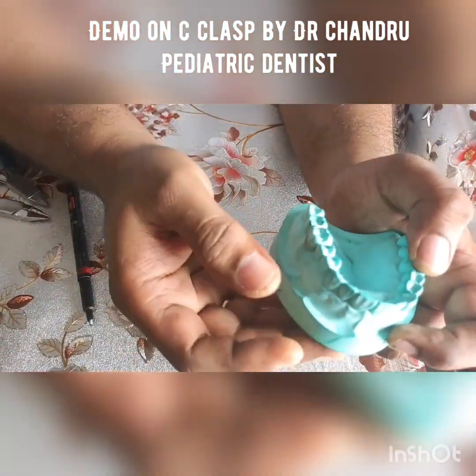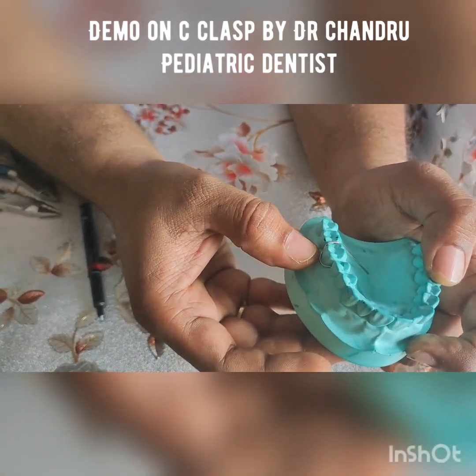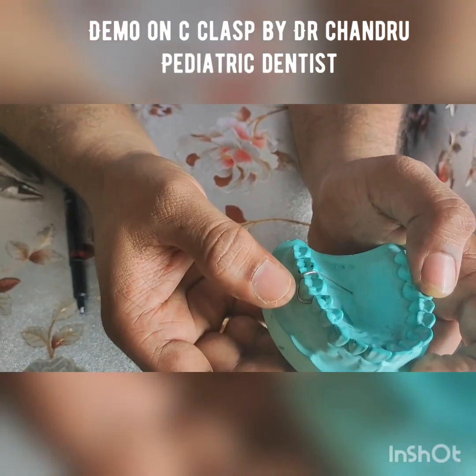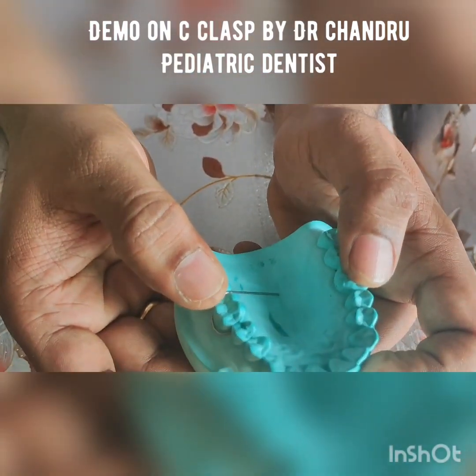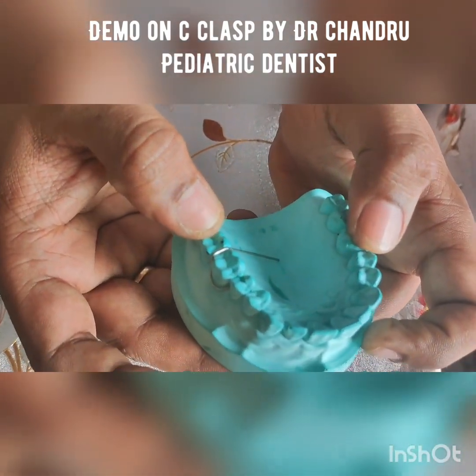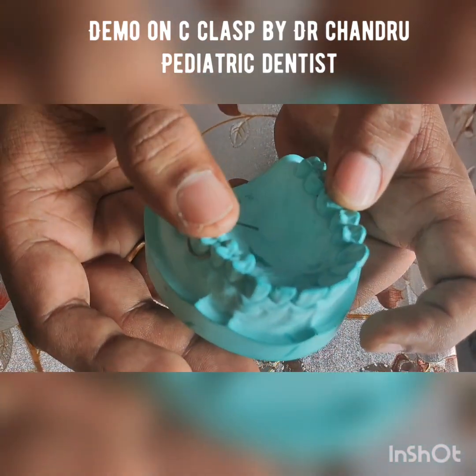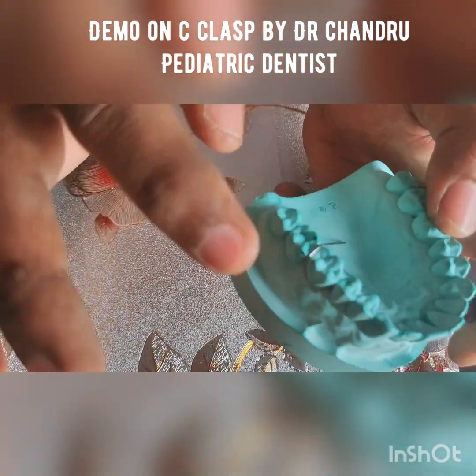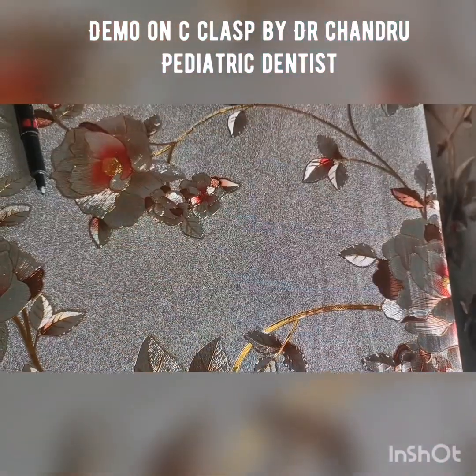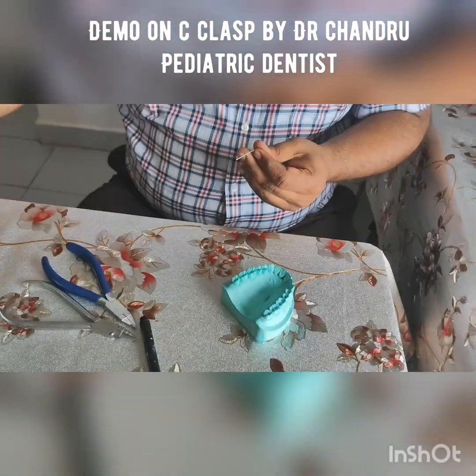Now you can see that the wire is passing from the mesial undercut to the distal undercut, passing in between the interproximal embrasure areas. From there it is passing towards the occlusal surface, and there is no occlusal interference as such. This can be assessed by passing your thumb or index finger and seeing whether there is any lift of the wire present or not. Once it has been done, now the palatal adaptation comes into the picture.